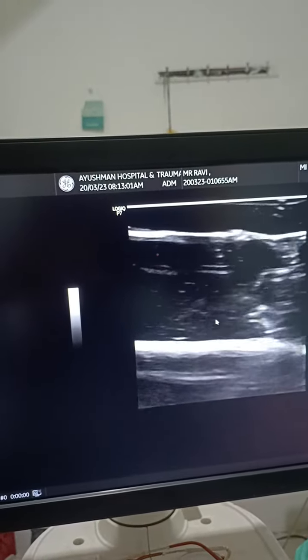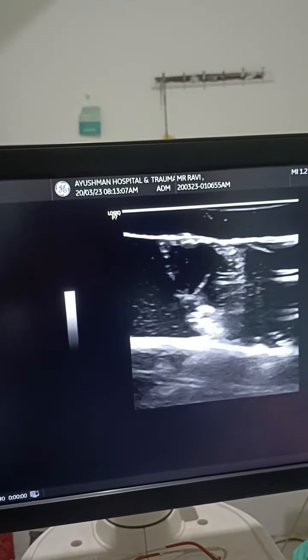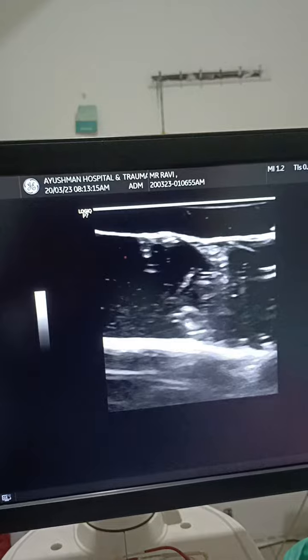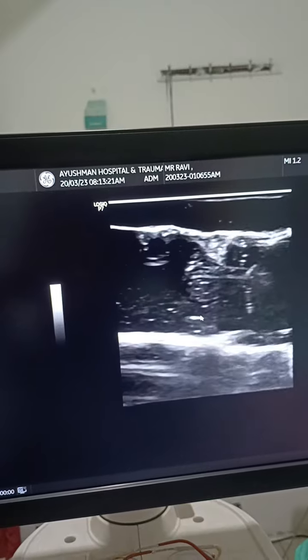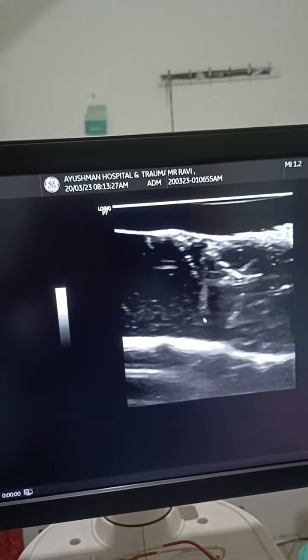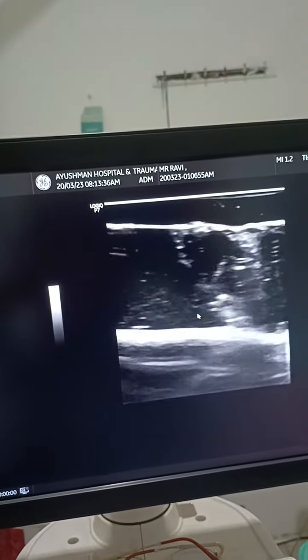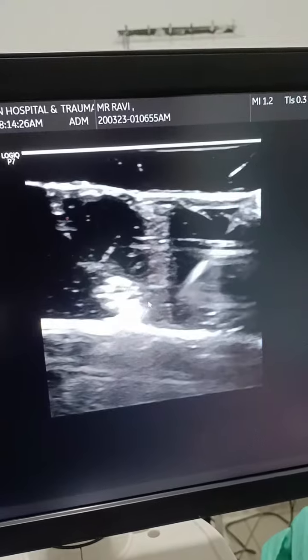So withdraw and change your direction. We have to go at the base — the base of the artery. We have to change our angle.